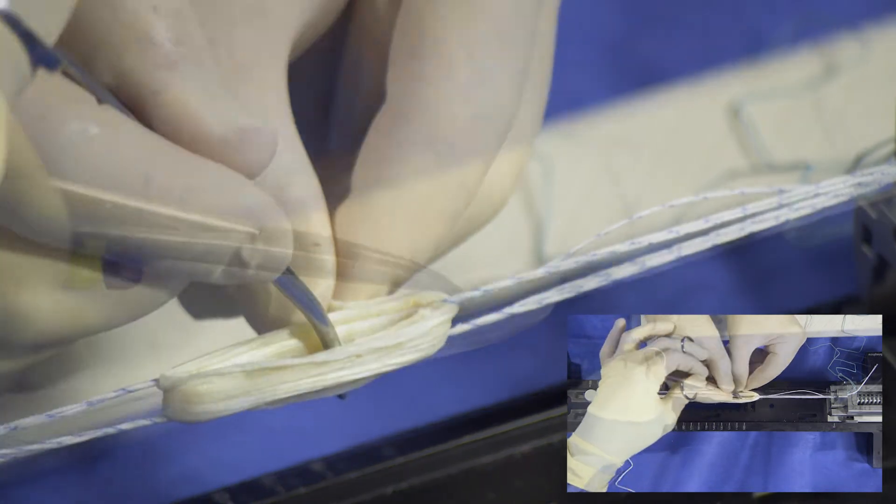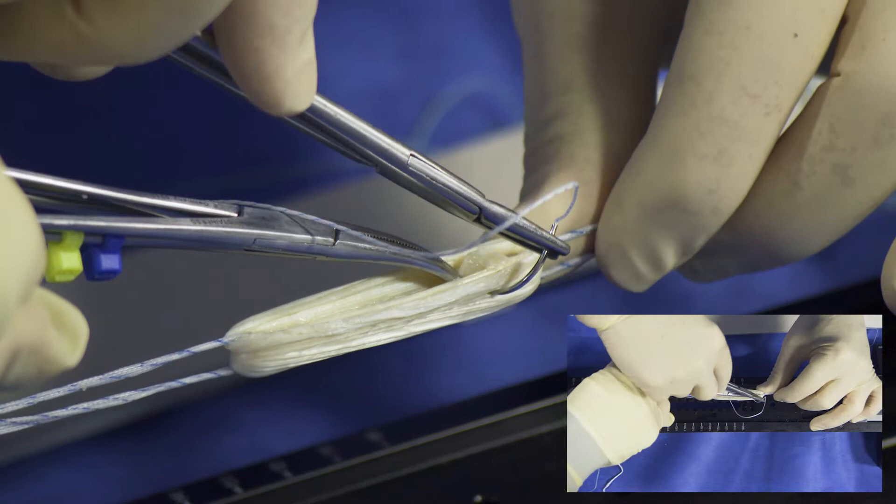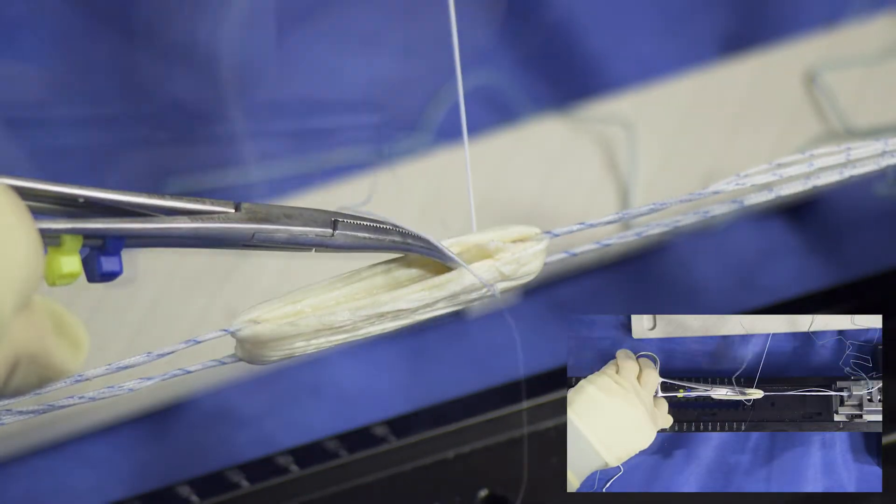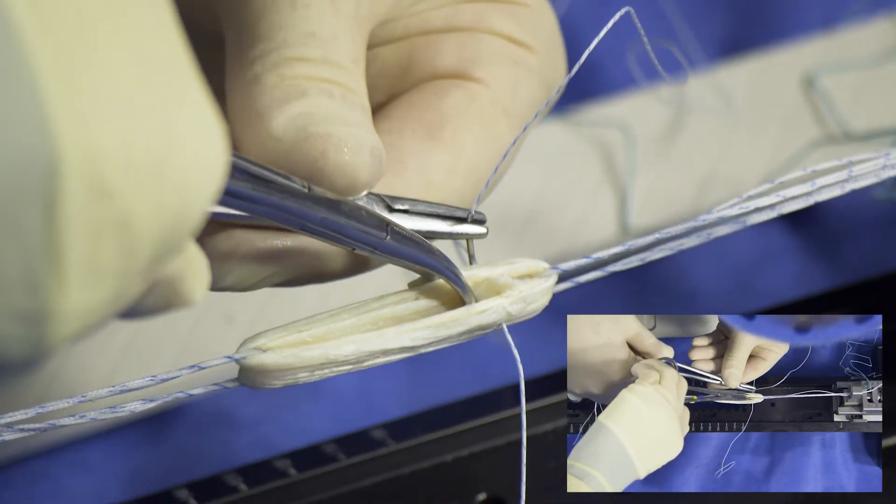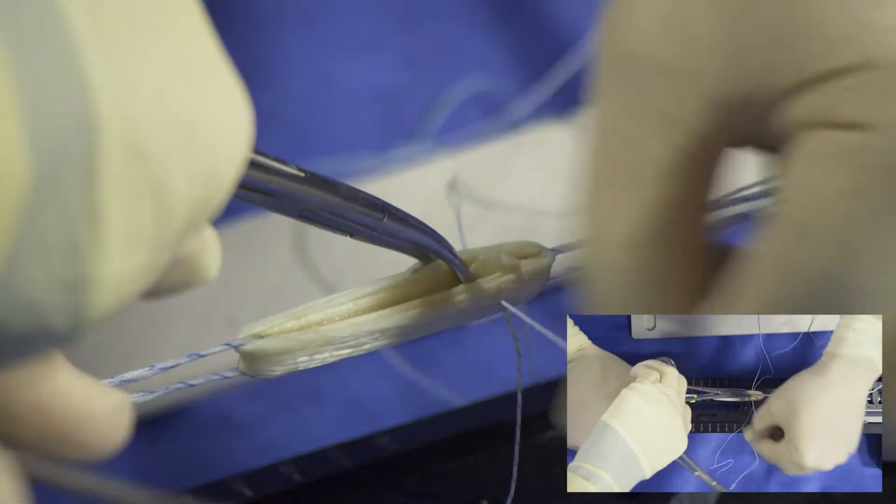The tendon is secured to itself with multiple 2-0 braided non-absorbable sutures. The goal is to keep the tendon from slipping on itself. The needle is passed through all six strands of tendon.